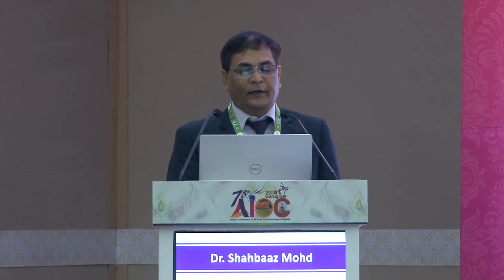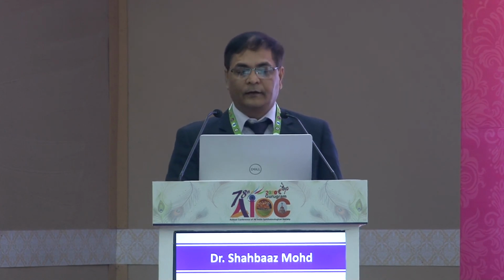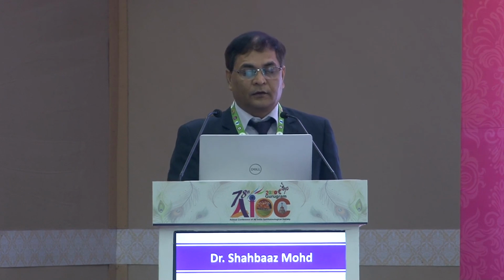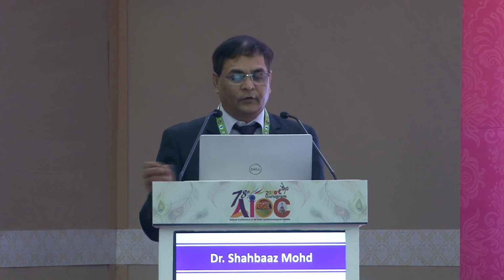If they are using contact lenses, we should discontinue the contact lens at least 2 weeks before, because this will change the tear film and the mires will not be good. You will get 3 mires in that, and you have to align this plus with the other plus and minus with minus. This gives the central 3 millimeter of the corneal diameter. Automated we have already seen; it is very simple, anybody can do it, and the handheld can be used in cases like uncooperative patients.